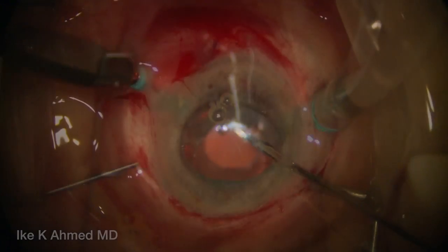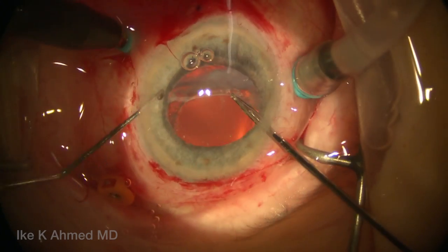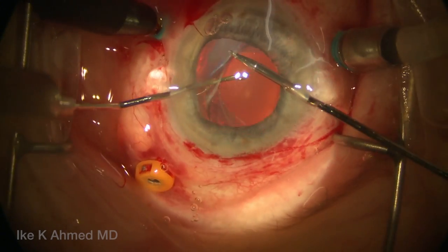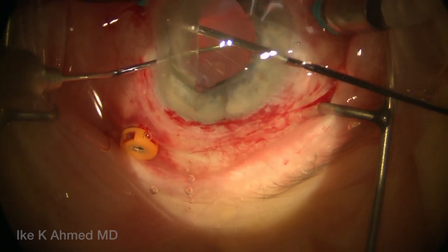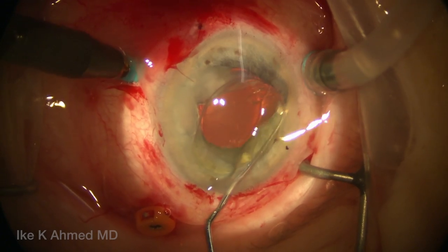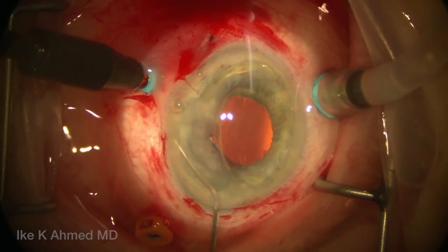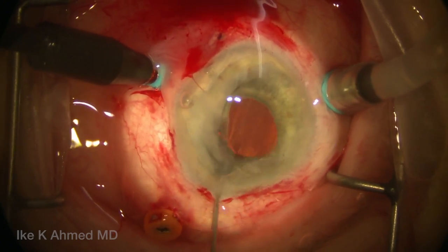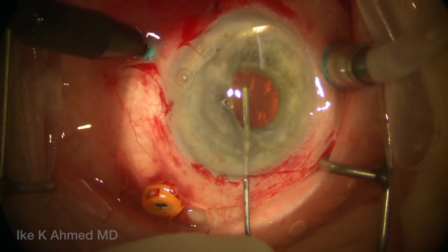We can now proceed to visualize the IOL complex, injecting some viscoelastic to keep the anterior chamber formed. All the while, we're holding the IOL complex with our micrograsper. Now a Kuglen hook is used to spread the iris and pupil here and levitate the IOL into the anterior chamber. The infusion line is kept on, the bottle height has been reduced slightly, and the IOL has been brought into the anterior chamber. Once the IOL is in the anterior chamber, we maneuver it and inject miochol to bring the pupil down. Our vitrectomy has been completed, and we use miochol to protect the anterior chamber–posterior chamber barrier.